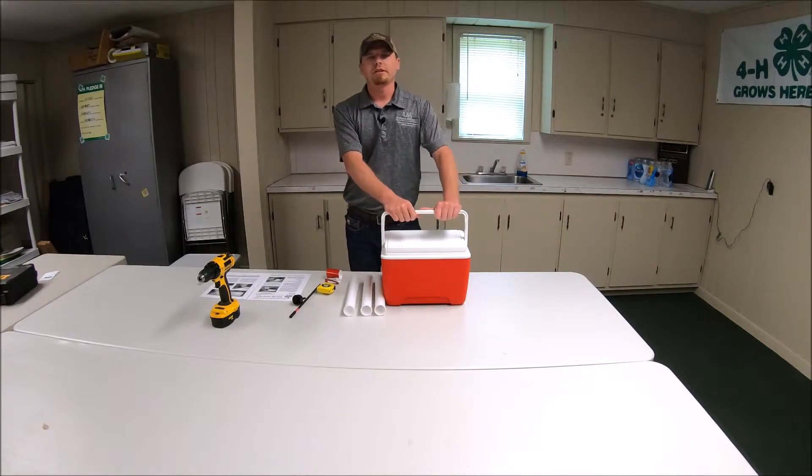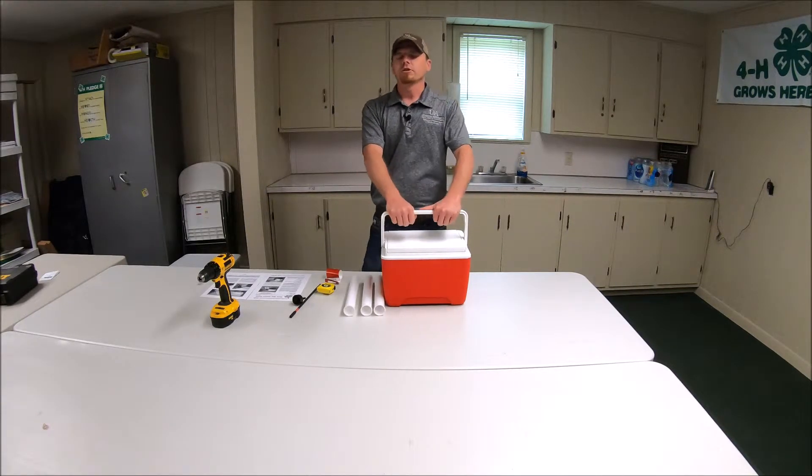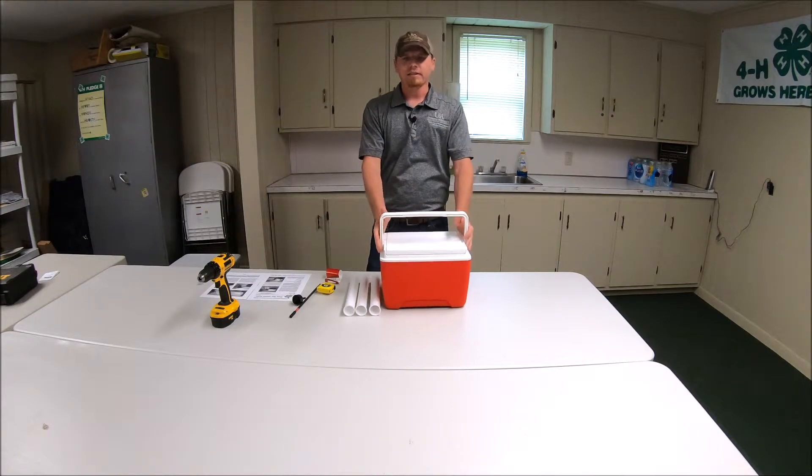Hello, this is Brian C., your Marin County Extension agent, and today we're going to go over how to make a vaccine cooler.